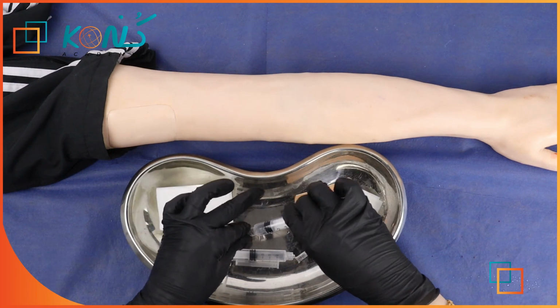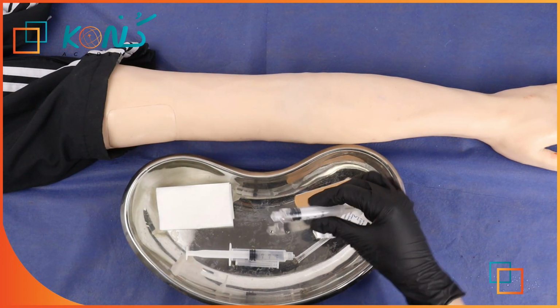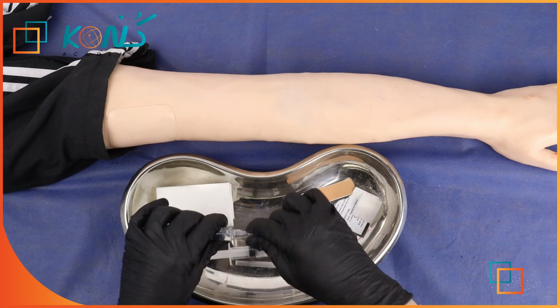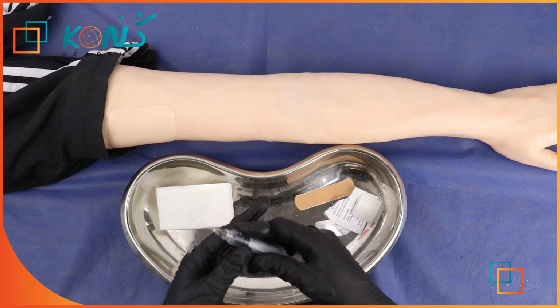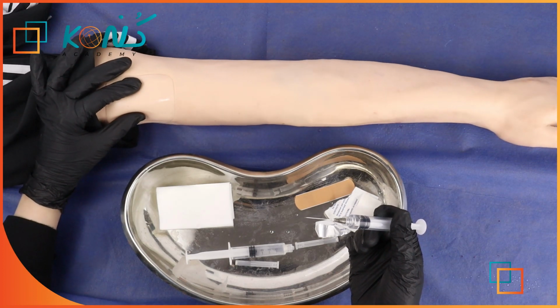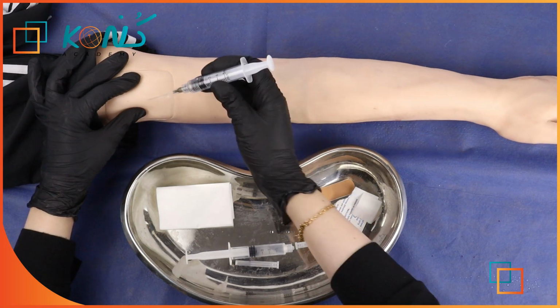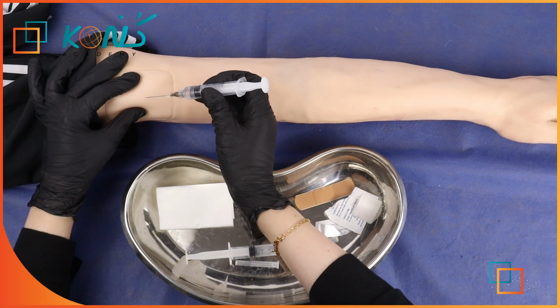you will change the needle, remove it in the sharps bin, and then put the other needle, and then warn the patient, sharp scratch coming. Take a fold of the skin, make sure you are not holding muscle in between, and then insert the needle at 45 degrees.